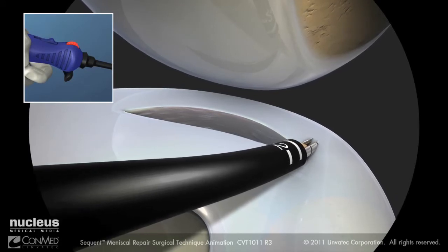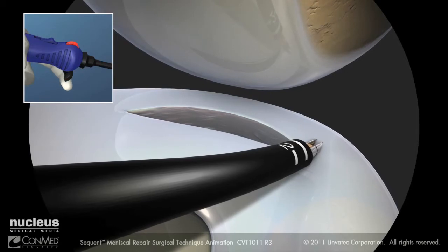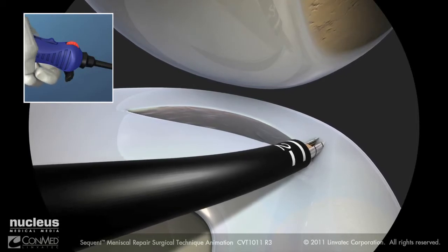To place the first implant, advance the trigger forward to prepare the device for implant deployment. Then pull back and release the trigger to deploy an implant. Withdraw the needle from the meniscus.